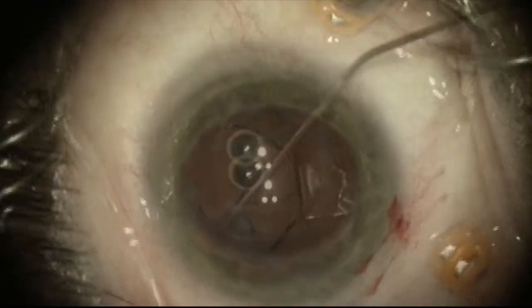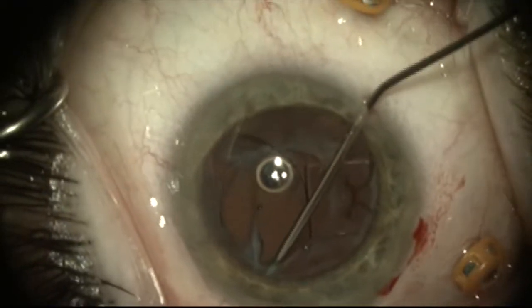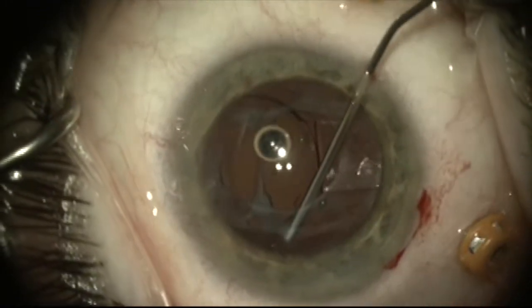Once this is done, I can safely manipulate the lens. Here I'm using viscoelastic to try to dissect the anterior and posterior capsule fibrosis a bit and free up the lens.